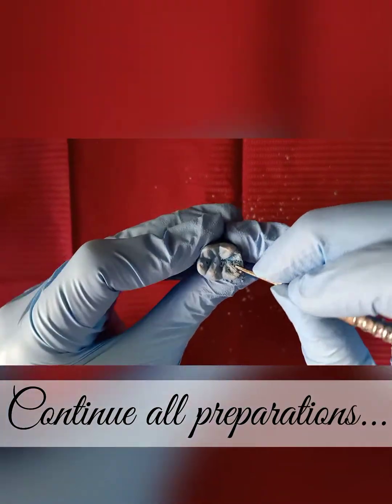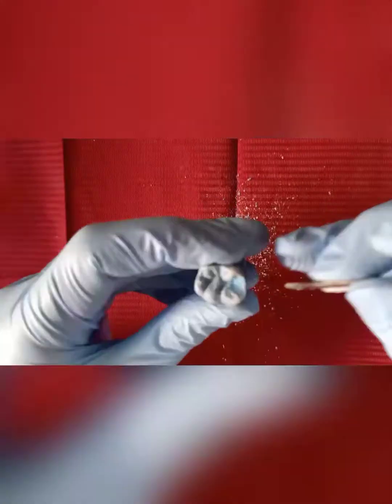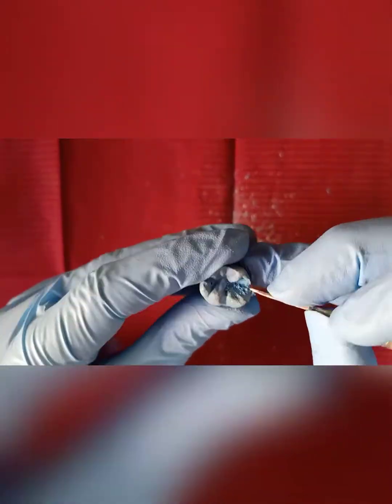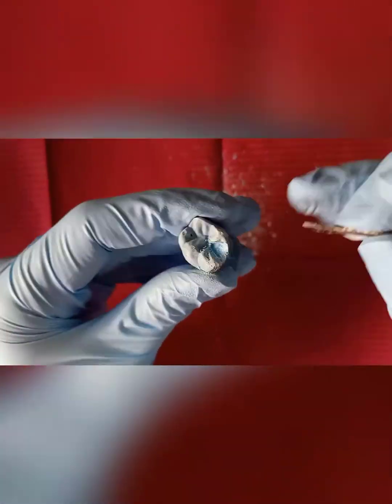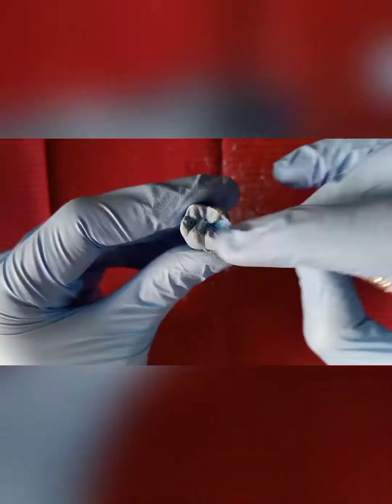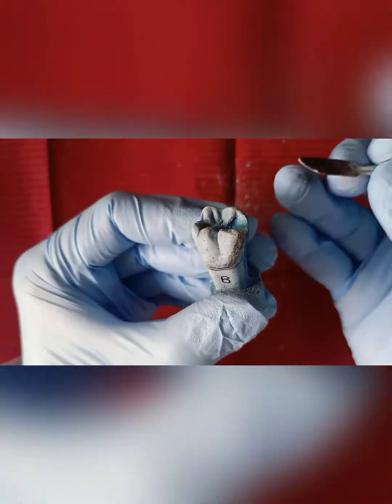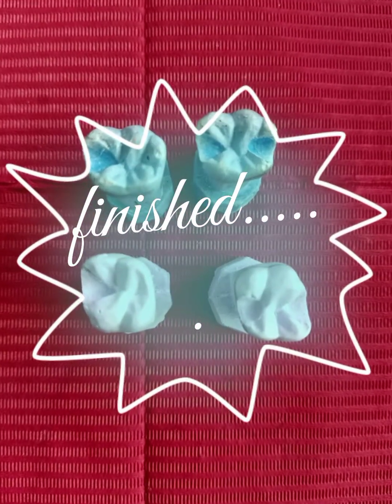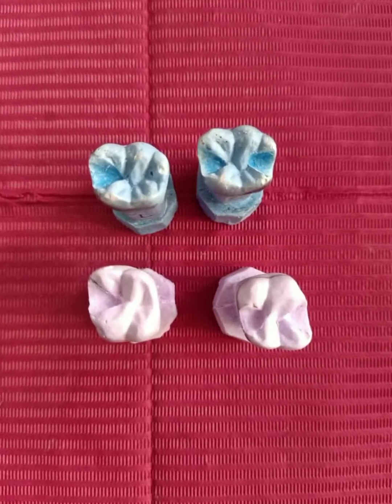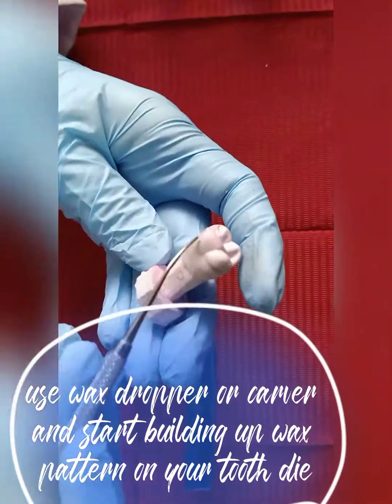Continue doing all your preparations. Keep it neat. Remember that you have to remove an amount that's proper to be replaced by wax, that should not be above the occlusal surface of the tooth. Now this is the finished preparation, and let's start the waxing up time.